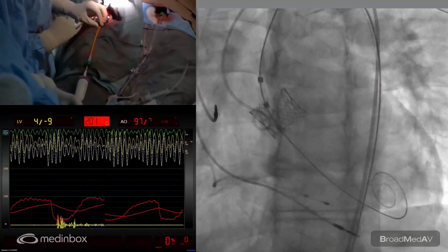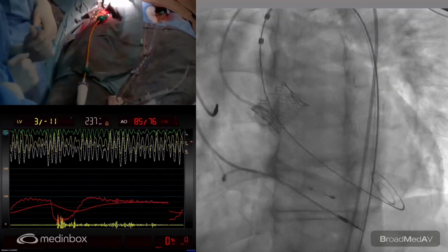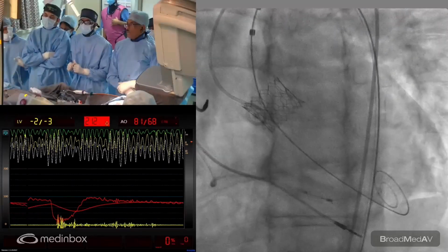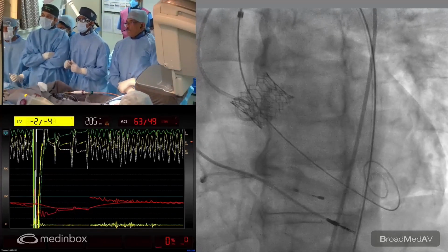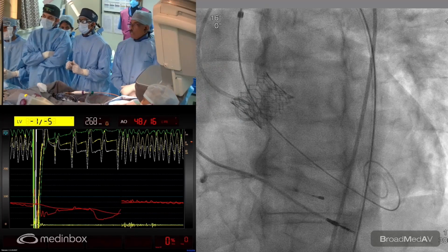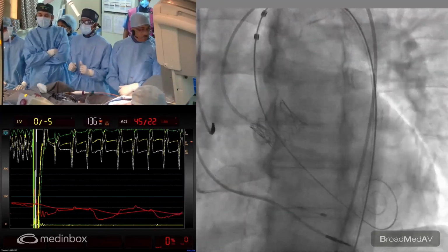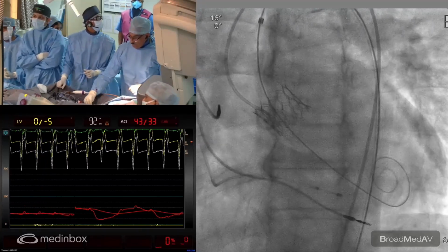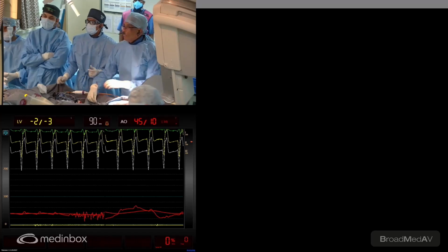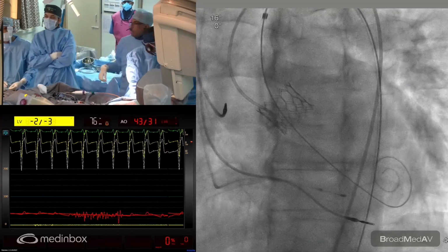Yeah, just shock please. Put the device and shock, shock. All right. So we should be ready for all this. Just support the pressure for a bit. Some volume and pressure, support pressure, please. Okay, no pressures. Let me massage for some time.